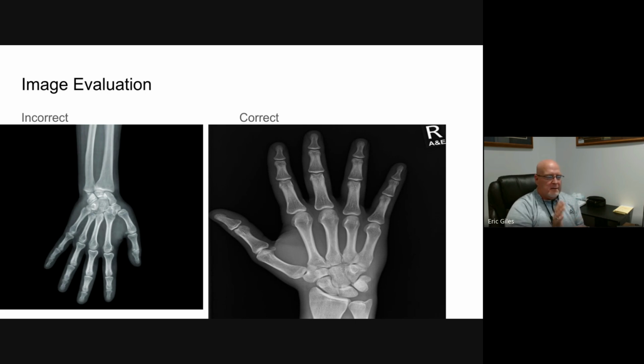Okay. Now, like we said before, fingers, hand, wrist, forearm are all hung from the fingers, right? Here we are. We're hung from the fingers, meaning it's like somebody's grabbing the top of the finger and hanging it there in front of you, right? And it's a right. So if I put my hand out here and look at that, is this my right hand? Yes, it is. And it looks just like that. So it's correct. Okay. If we put our hand up here and it's supposed to be a left, it's going to look completely different.